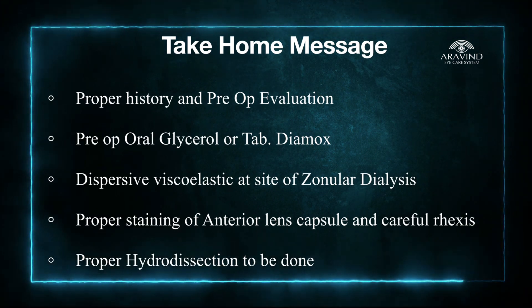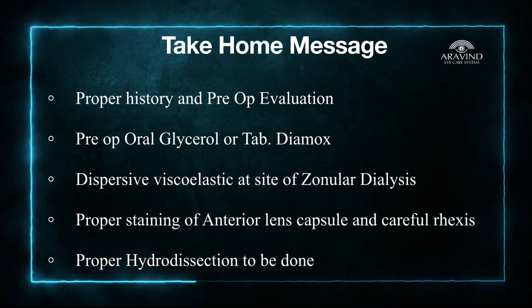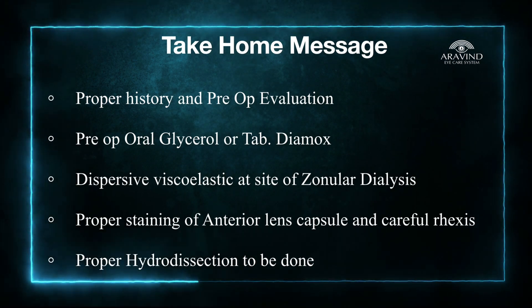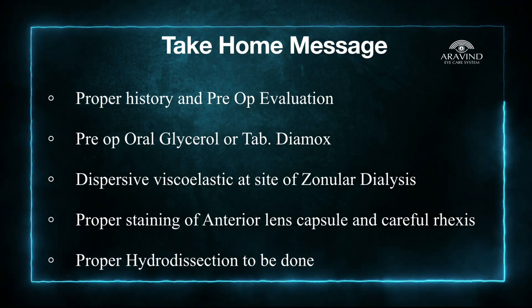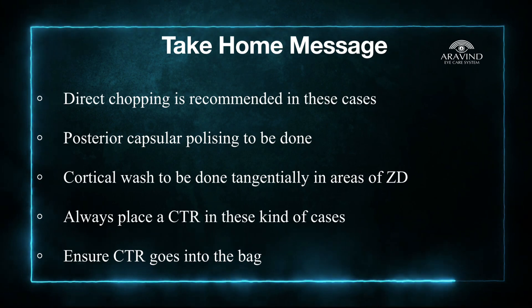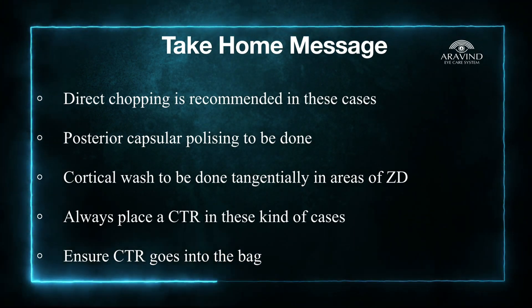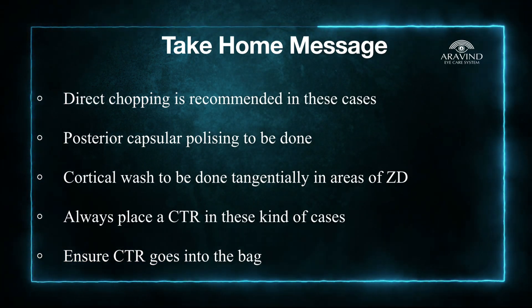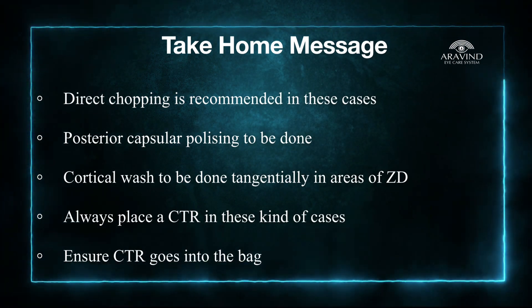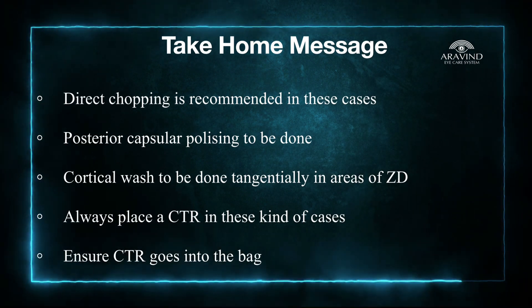Proper staining of the anterior lens capsule is very important. Be careful while performing rhexis at the site of zonular dialysis as there is a high chance of rhexis extension. A perfect hydrodissection is required in such cases to have smoother cortex removal. Direct chopping of the nucleus is recommended in order to prevent worsening of the zonular dialysis. Always do a posterior capsular polishing. In the areas of strong zonules, pull the cortex radially, and in the areas of zonular dehiscence, cortical wash must be done tangentially along the rhexis margin.